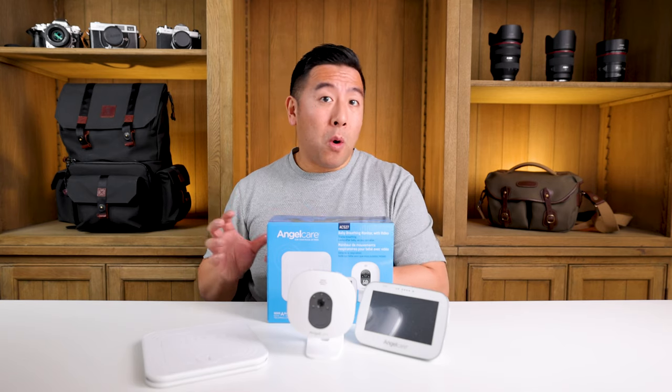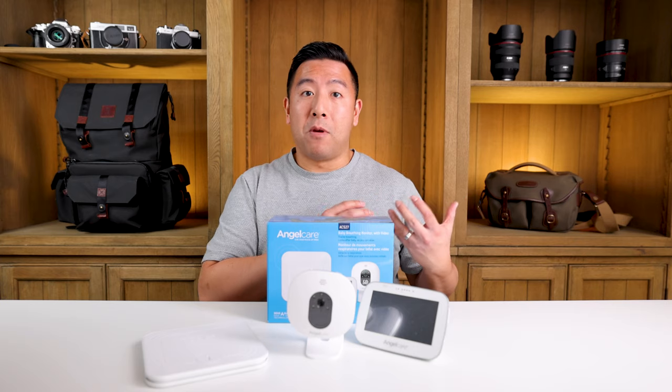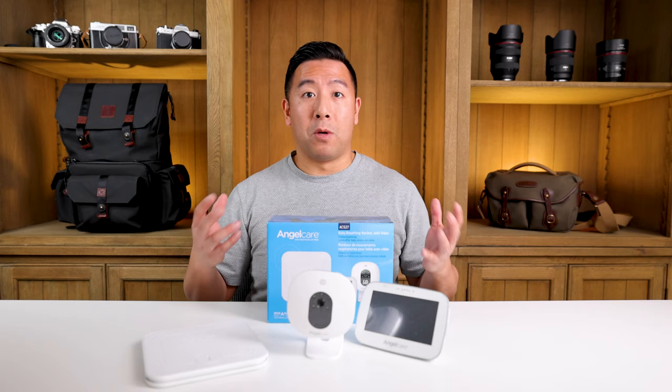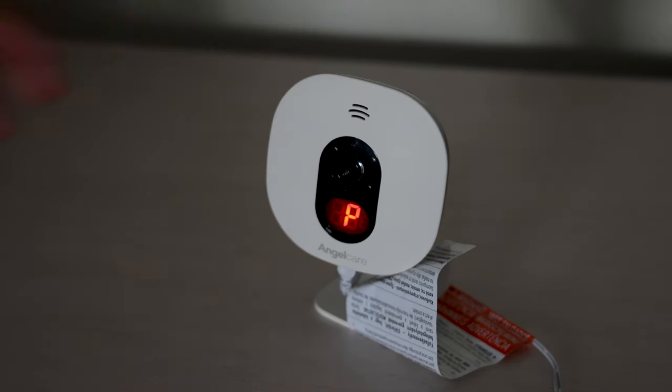Another annoying thing is if you forget to pause the camera before you pick up your baby, it's going to start alarming even though you're in the other room or changing a diaper. You have to make sure you pause it first before picking up your baby.